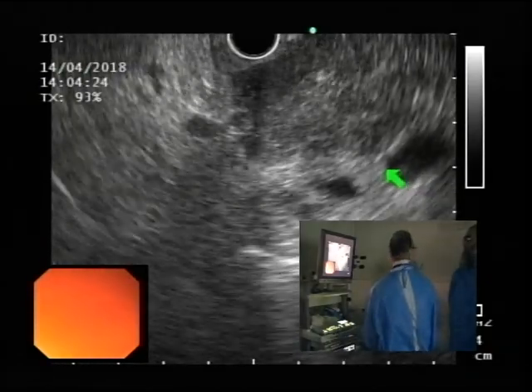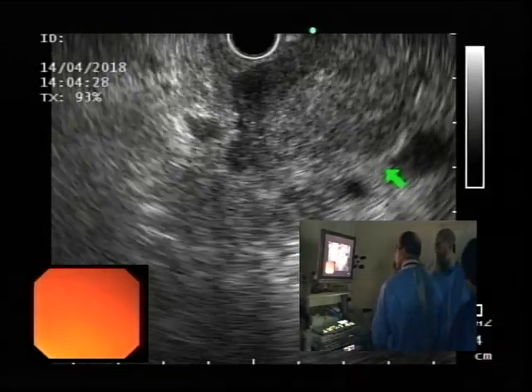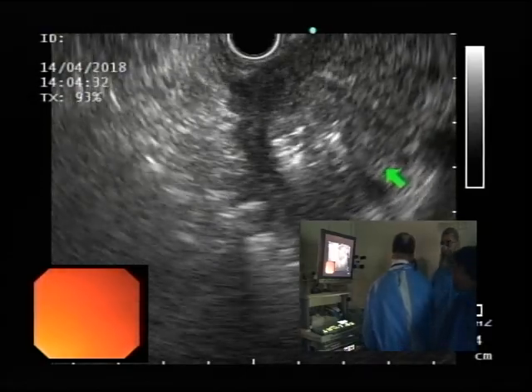So again I'm doing a lot of thumb down. ठीक है. So I'm flexing into it a lot. अच्छा. अच्छा. Sure.